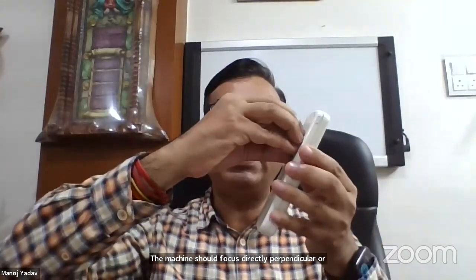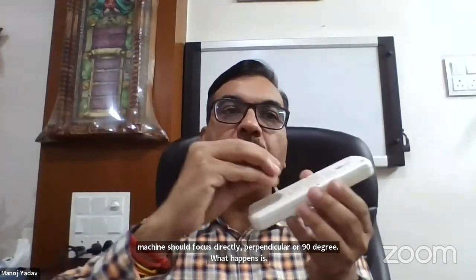Second is the orientation and all these things in an ICU. If you are having an ICU patient, you are seeing the X-rays, or in some patients the X-rays are taken daily or every other day, the orientation may not be proper. If the patient is lying like this, the machine should focus directly, perpendicular, or 90 degrees. What happens is the patient is like this and it is short like this, so you have more of an oblique view.